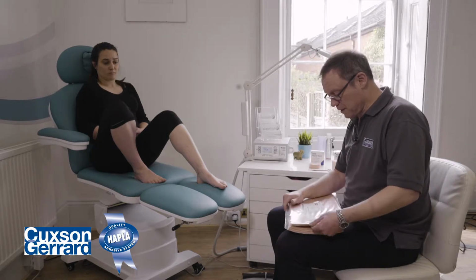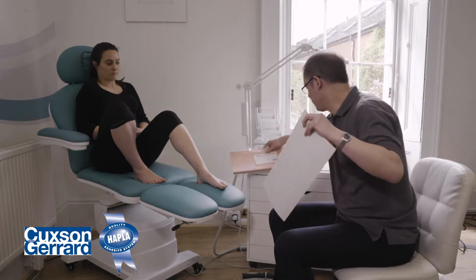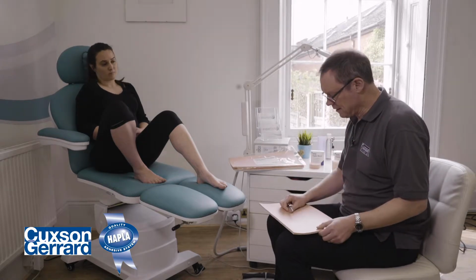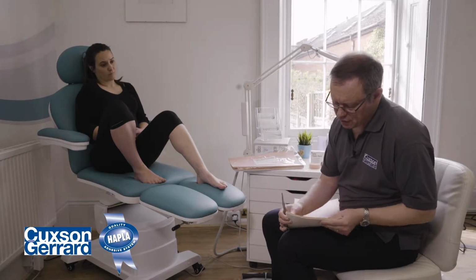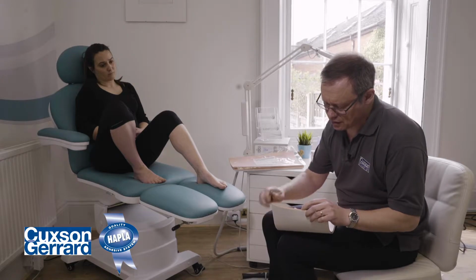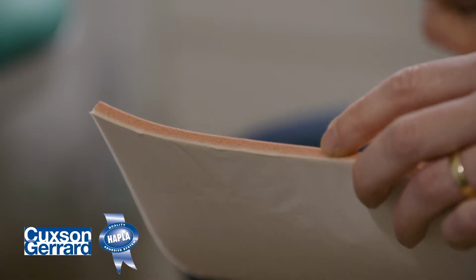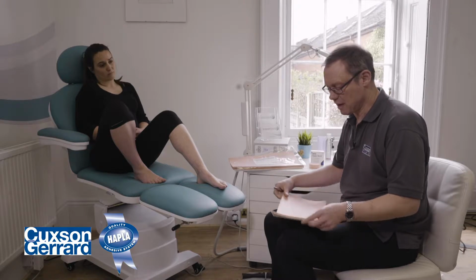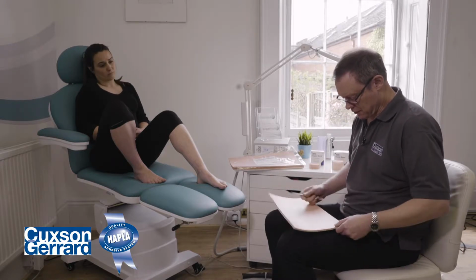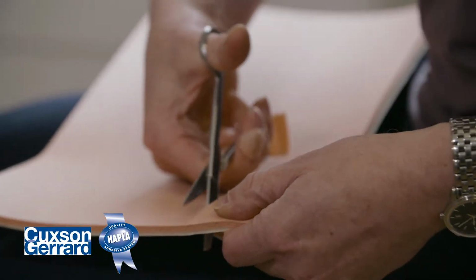So let's take some of this 7mm foamer felt. Okay, put that down there. And for this pad, which is quite small, the arrangement of the foam and the felt is very useful here, because we're going to cut into the felt to create our aperture, but we're leaving a foam lid over the top to provide that cushioning where footwear has pressed on that area. So let's cut out ourselves a little piece of this foamer felt first. Put that to one side.